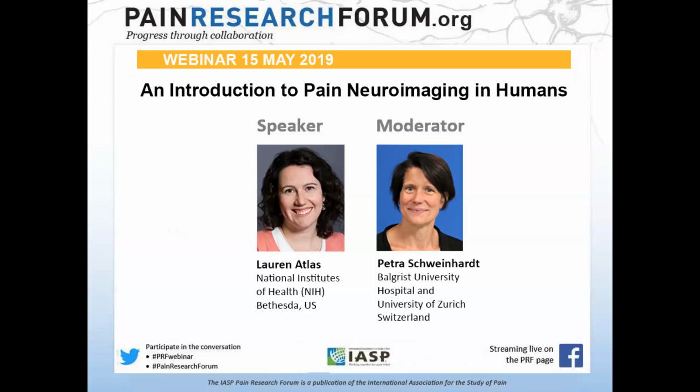And this is typically what we see in papers. And then that's why I appreciated you showing the raw images, because that gives a better sense, I think, of the noisy environment the data are actually coming from. So question to you, Lauren, do you think we should actually publish raw EPI images in our brain imaging papers? So for the audience, sorry, EPI images being the typical functional image.